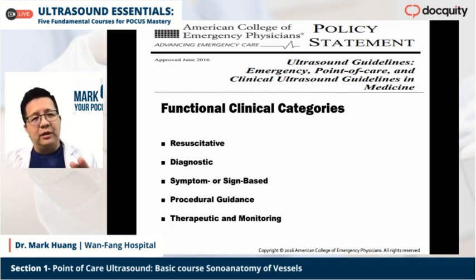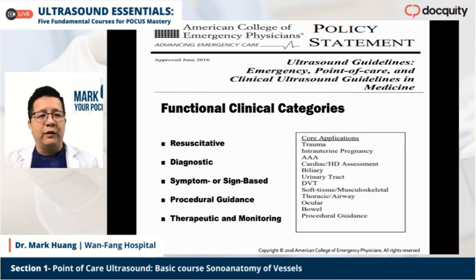Actually, we will learn many functional clinical categories, such as resuscitative, diagnostic, and symptom- or sign-based, which are essential. But today I will focus on two major vessel systems. The first is the abdominal aorta, so we need to learn the sonographic anatomy of the aorta. And we will learn DVT, deep vein thrombosis.